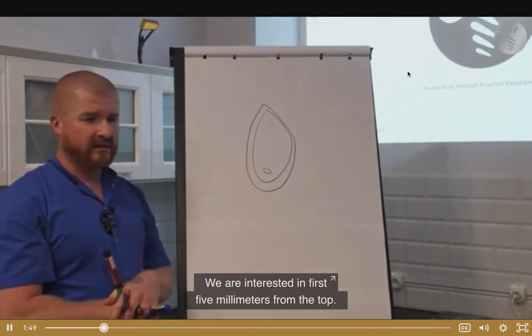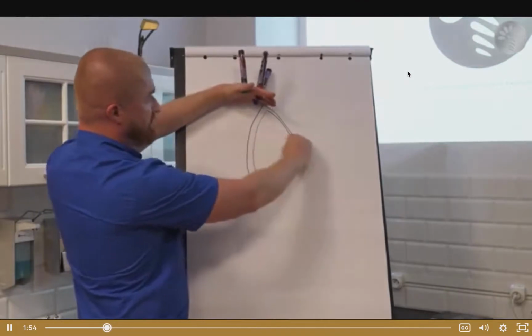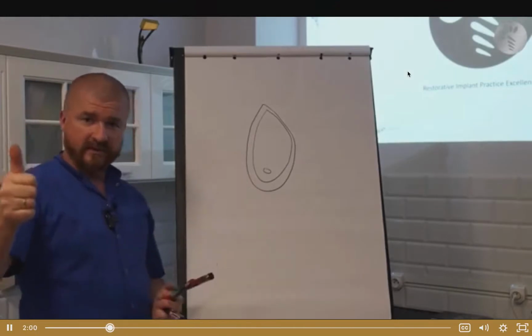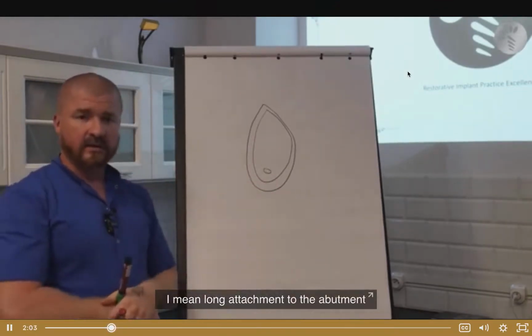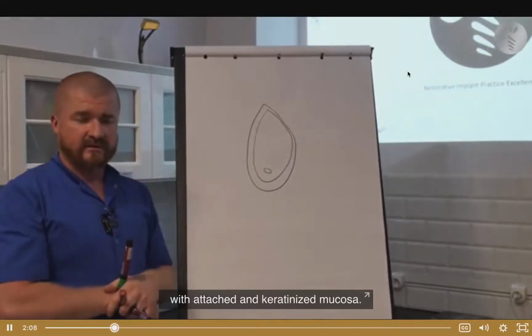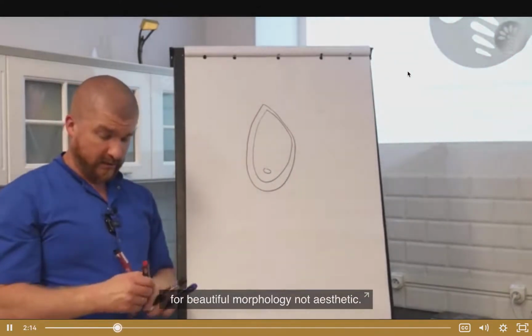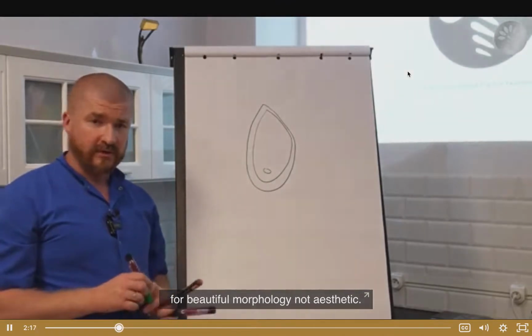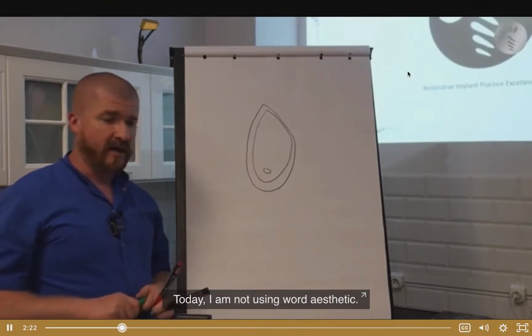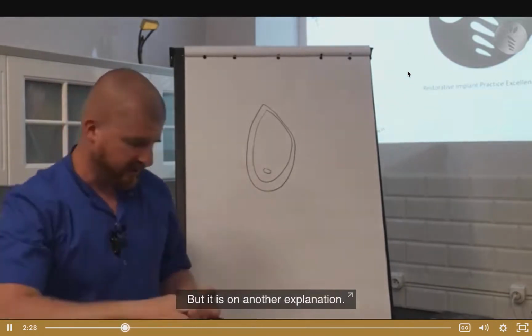We are interested in the first 5 millimeters from the top. That region is the most important for the safety of the implant. I mean, long attachment to the abutment with attached and keratinized mucosa, and of course a good emergence profile for beautiful morphology, not aesthetic. Today I'm not using the word aesthetic. I'm creating the same morphology like before the defect. But this is another explanation.